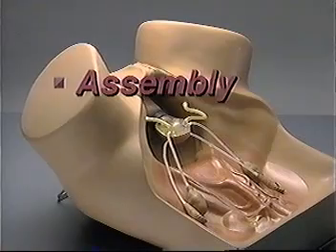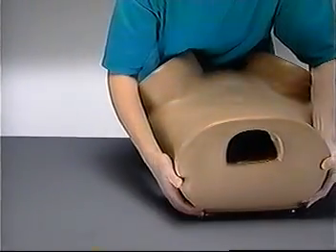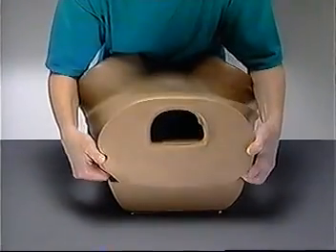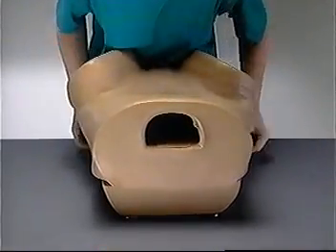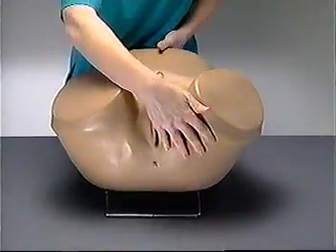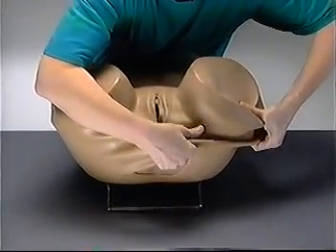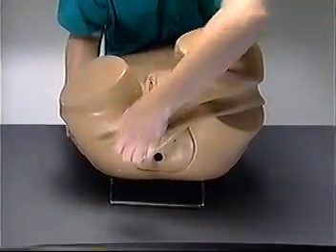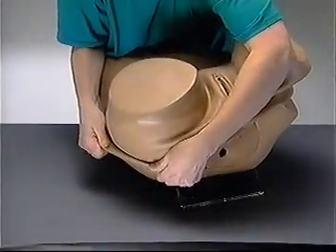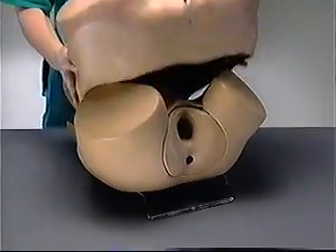Assembly. To view the anatomical parts inside of ZOE, first you'll need to remove the skin. To do so, start at the top of the model. Carefully pull the skin and its foam lining away from the rigid base as one unit. Lift the skin and foam up and over the legs one leg at a time. Be as gentle as possible. This shell is made of material that approximates skin texture and it can tear.